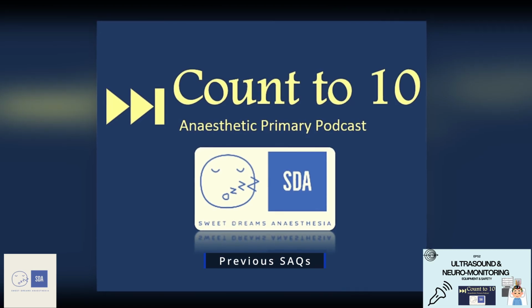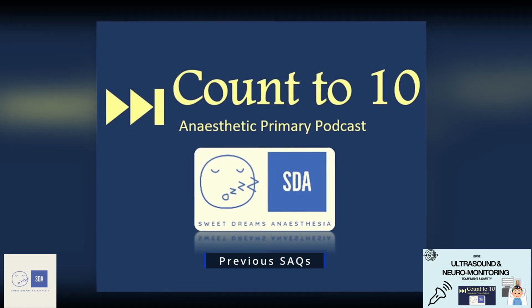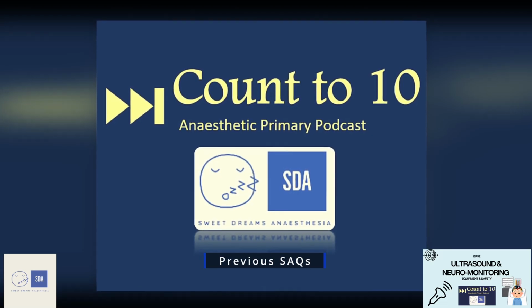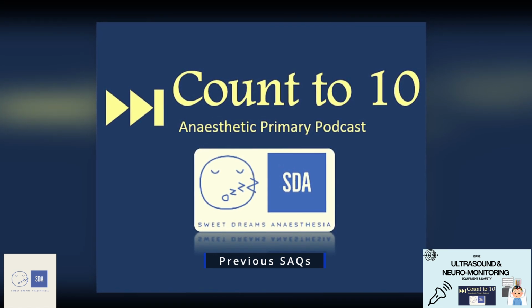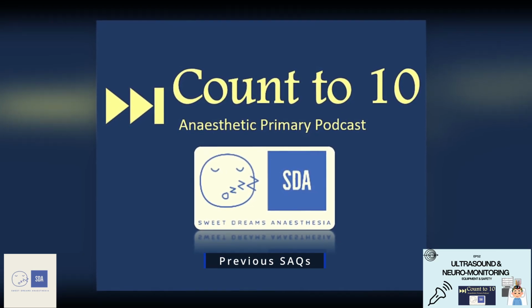Then you can go on to how Doppler ultrasound works because it needs that fundamental principle of frequency changes of a moving object relative to the observer, and in this case, the observer is the ultrasound probe, and the thing that's moving is generally what we're measuring, which is the blood velocity. So to quantify that, we then have the Doppler equation, which can be rearranged to figure out the velocity of the object, being the velocity of blood.